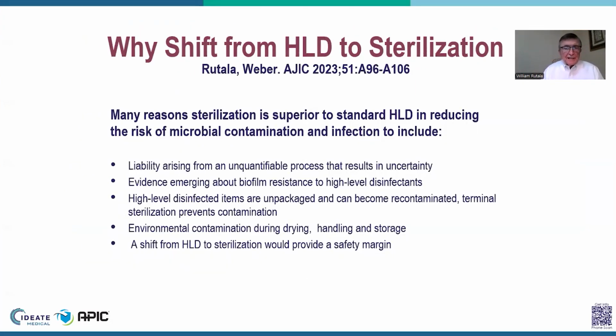In the next slide, we will see a few other reasons, to include liability arising from an unquantifiable process that results in uncertainty. Many of you may know there's been dozens of lawsuits associated with reprocessing of flexible gastroendoscopes that have been high-level disinfected. Of course, we have evidence emerging about biofilm resistance to high-level disinfectants.